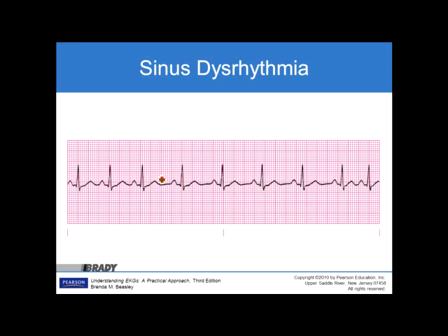With the sinus dysrhythmia, if you'll notice, these distances will change. In this area here, this one got wider, this one's wider even a little bit more still, and so is this one, and this one as well. These are all wider, and this right here is about the same as this one.